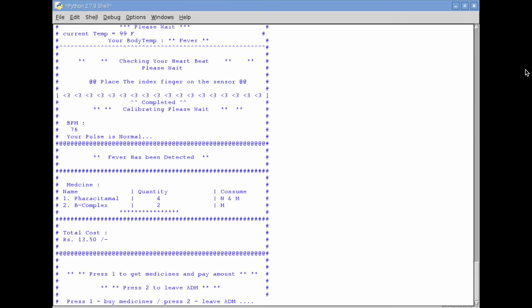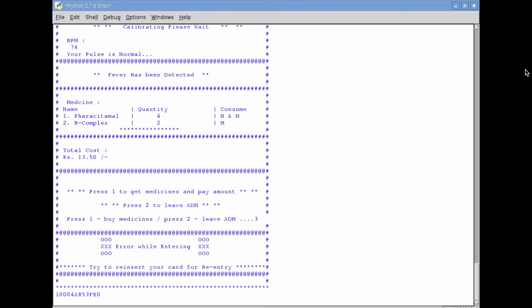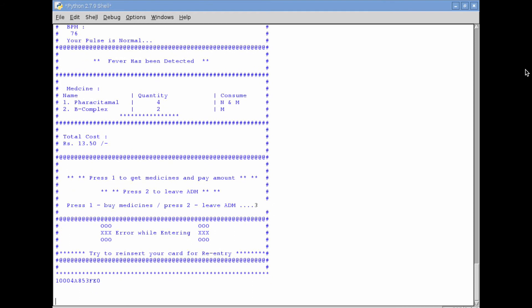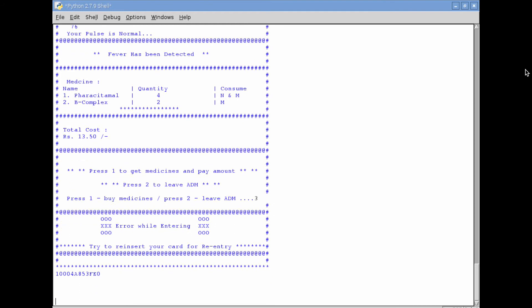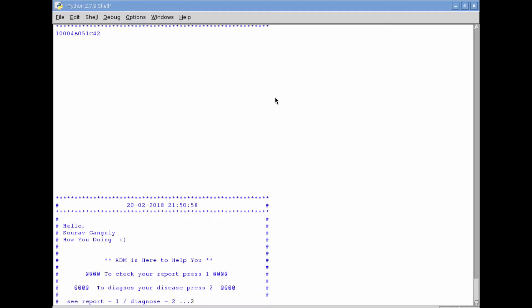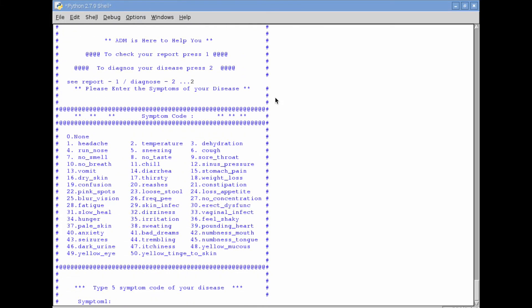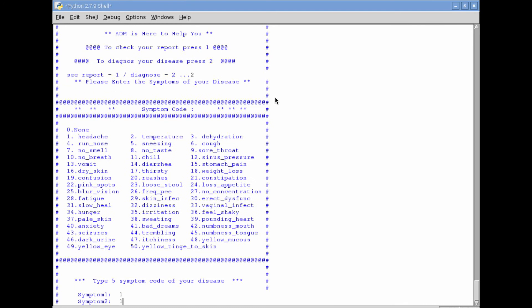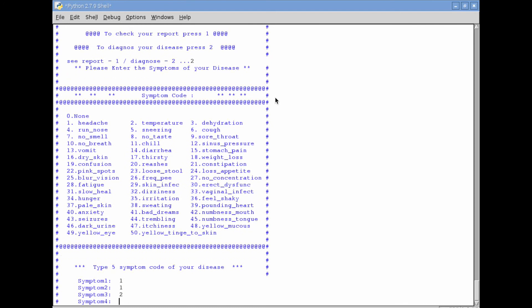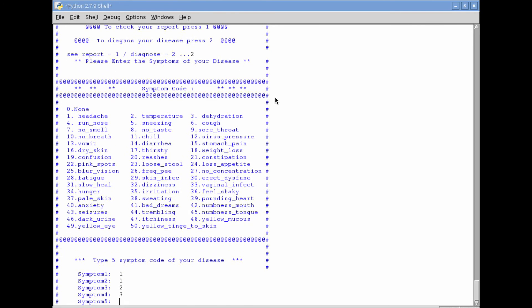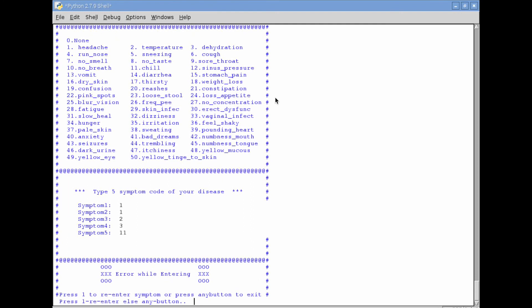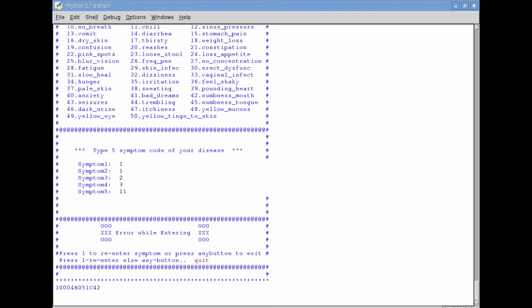Now, case three — the third test scenario. What I do is very simple: I am trying to buy medicine. If I press any other code other than the valid ADM code, the input won't be regarded as appropriate. Now for the third one, when it comes to the symptoms, I press 1, 1, 2, 3, and 11. I have re-entered one symptom twice — 1, 1 — so it is not an appropriate input as far as the machine is concerned, and it will ask you to enter a correct input.